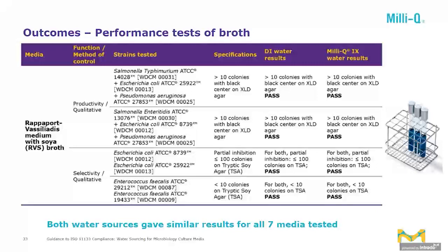This is an example for a selective enrichment medium for a pathogen where we expect, if we have main differences, also differences in, especially, the enrichment of the Salmonella. So, as explained before, both water sources gave similar results for all 7 media tested, and you can download all the detailed results from this study in the application note, as my colleague Estelle has explained. And with this, I would like to hand over again to Estelle.